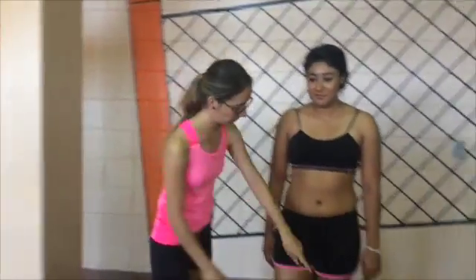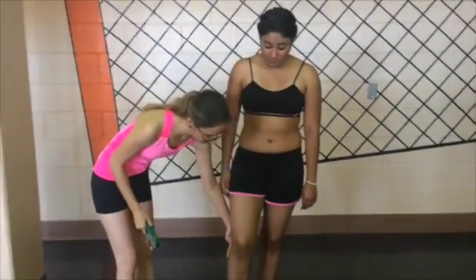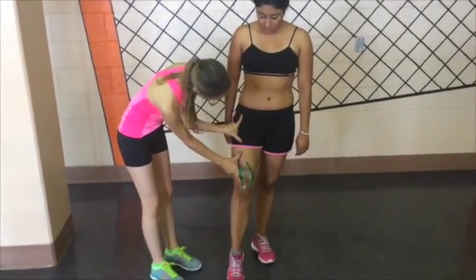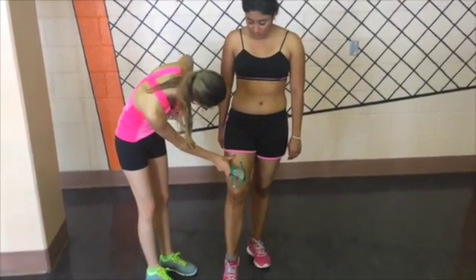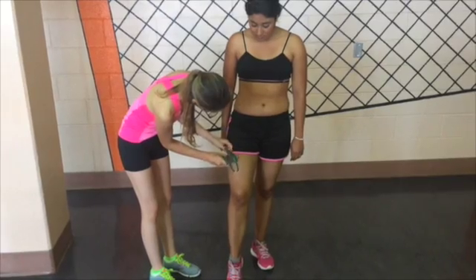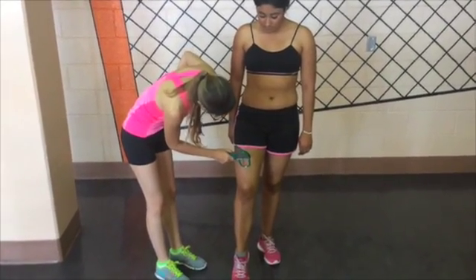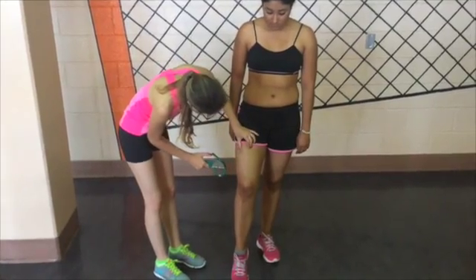The last measurement would be on the thigh. To minimize contraction of the thigh, the patient should put all their weight on the left foot so the right leg can be at rest. Make a vertical fold at the midpoint between the patella and the hip, and measure.